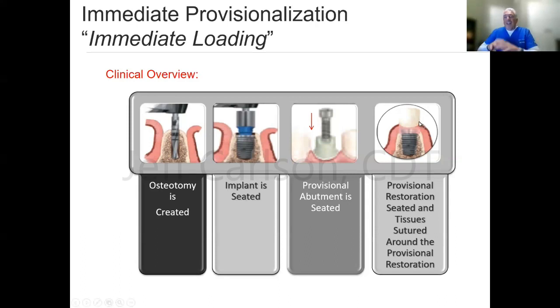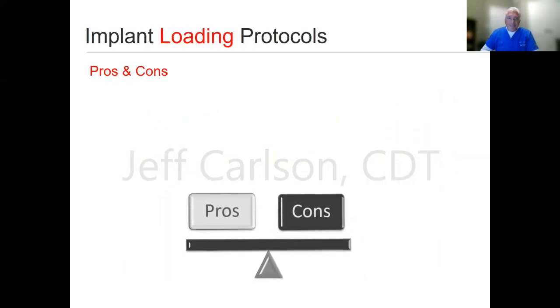and then a temporary crown contoured to the ideal contours. That way, when the clinician places the implant and sutures around that, they're not just developing a circumferential emergence profile; they're also getting buccolingual, buccopalatal profiles as well as mesial and distal, to help shape the interdental papilla. So it gives you much more control when you have a temporary crown utilized in this scenario to develop and manage that soft tissue, the visible matrix.